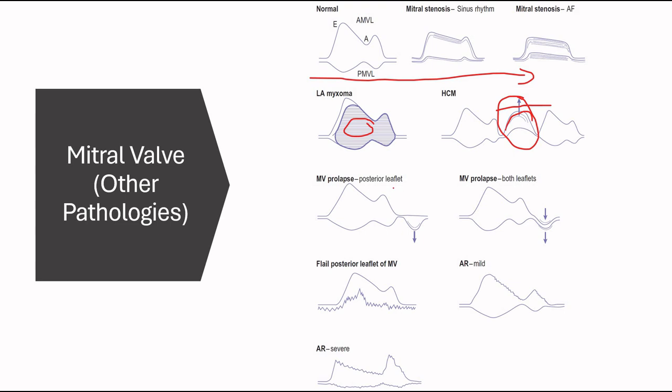In mitral valve prolapse, the posterior leaflet looks like this. And if both leaflets, they look like this. And these are in systole. Posterior flail leaflet of mitral valve appears to be like that. It flails into the opening of the mitral valves.